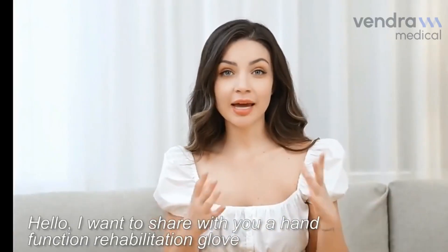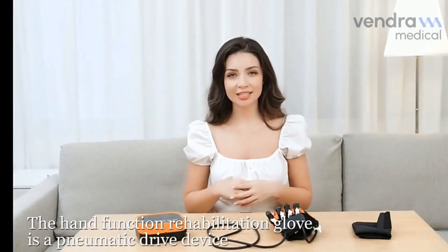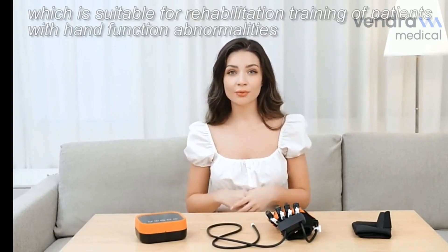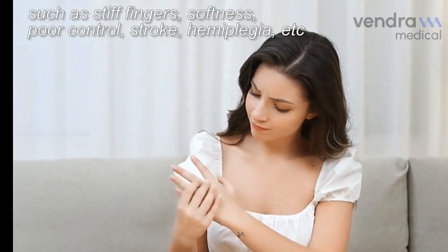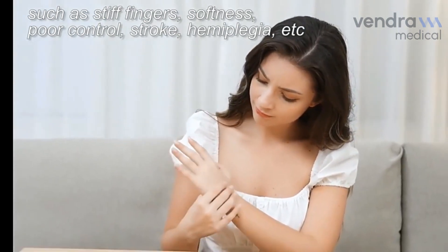Hello, I want to share with you a Hand Function Rehabilitation Glove. The Hand Function Rehabilitation Glove is a pneumatic drive device, which is suitable for rehabilitation training of patients with hand function abnormalities, such as stiff fingers, softness, poor control, stroke, hemiplegia and more.